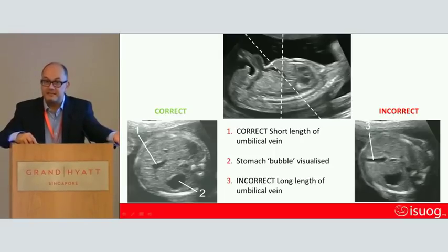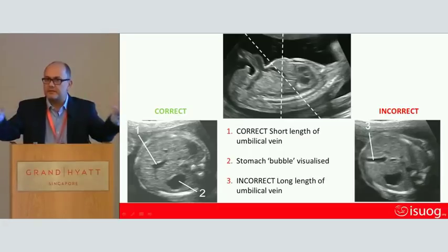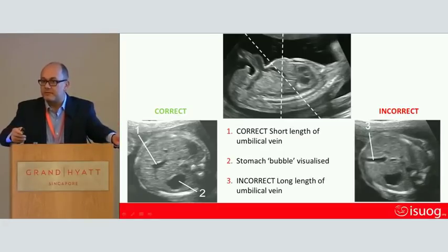We don't use AC for estimating gestational age because the AC is the one that changes most according to how the baby is being fed.